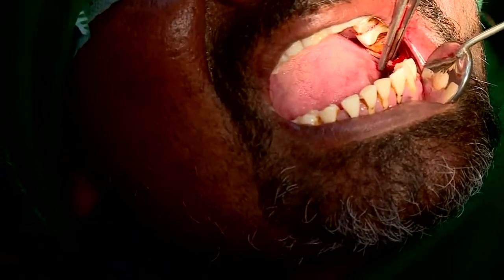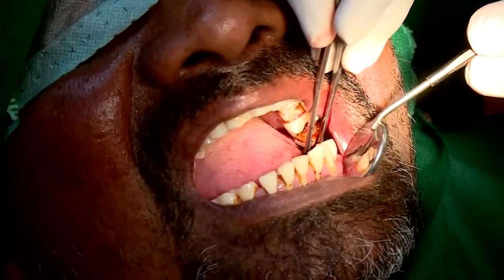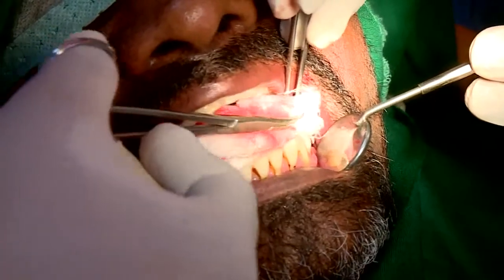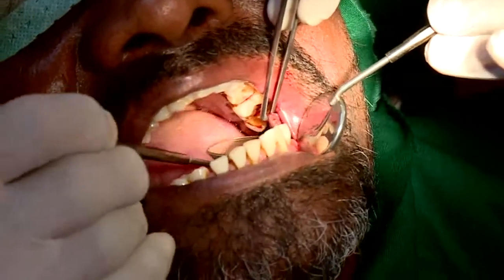Madam, can I just see the specimen once before I remove it? So the specimen is almost out. Can you all see the specimen getting expanded from the base? Can you see that?